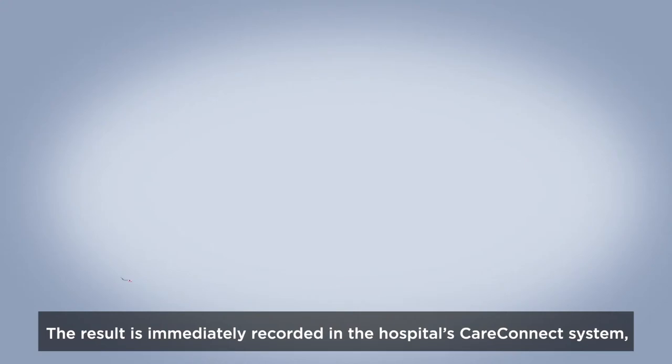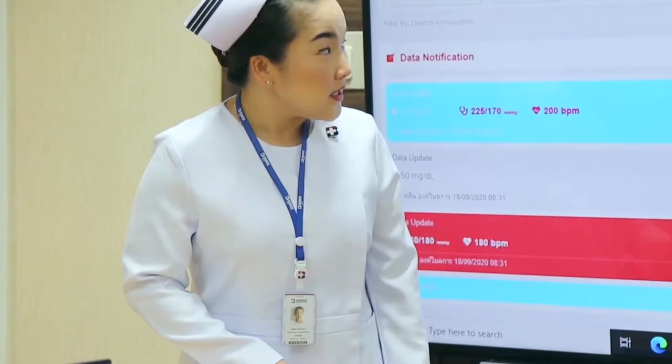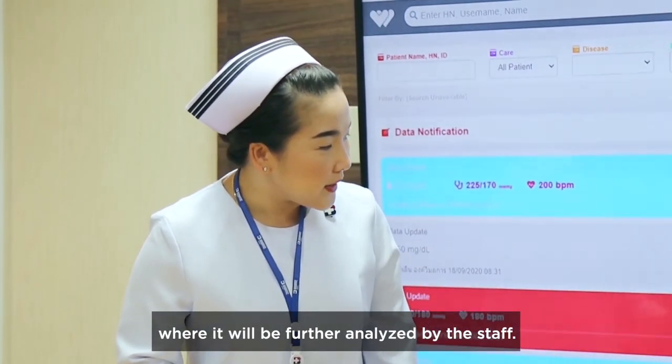The result is immediately recorded in the hospital's CareConnect system, where it will be further analyzed by the staff.